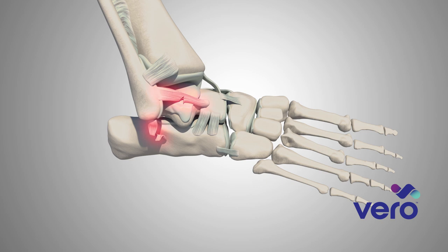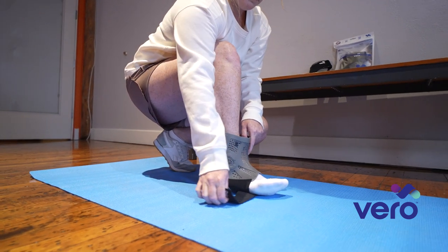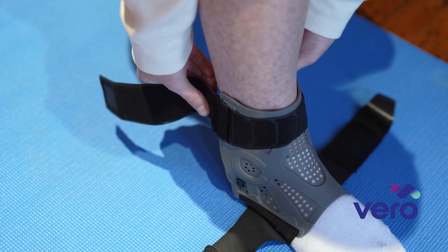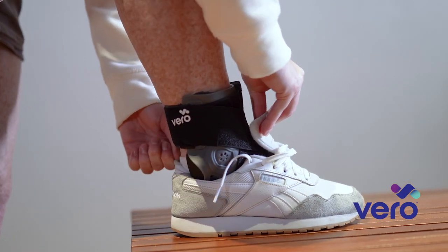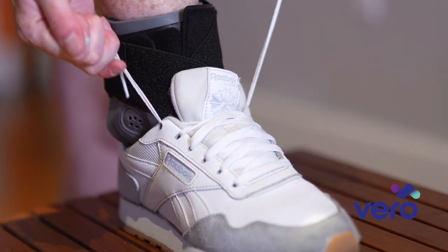The Vero Ankle Brace has applications for all types of ankle injuries — the acute stage, whether mild or severe, and later in the healing process after a sprain or fracture. At the acute stage, the Vero Ankle Brace provides maximum stability, compression, and support with over five unique design features and unique elastic materials. As the patient gains mobility and stability, they can make ongoing adjustments to the brace, allowing the support they need through their unique rehabilitation process to full recovery. The Vero Ankle Brace can also be worn with most shoes, providing continued support on the field, court, or job site.